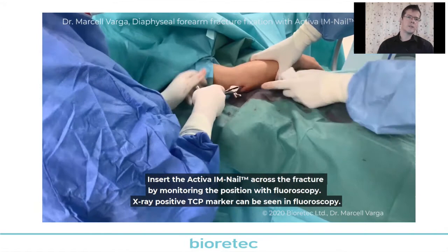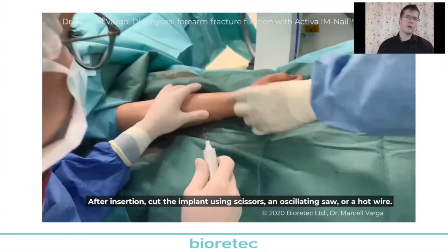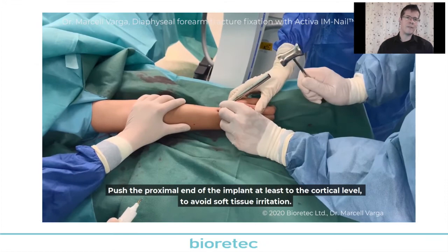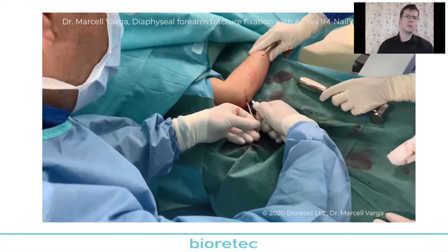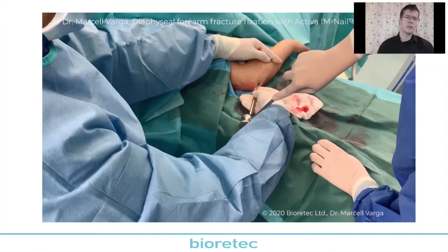Here I can see the TCP labeling on the fluoroscopy where I am momentarily. And with this special instrument, I can burn off the unnecessary part of the nail. And with light hammer blows, I take the implant to the level of the bone, only a small 1 or 2 millimeter step or even nothing. And here we can see I cut the unnecessary part of the ulnar nail, and with a light hammer blow again, I hammer it to the level of the bone, so that there shouldn't be any problem later with skin irritation.